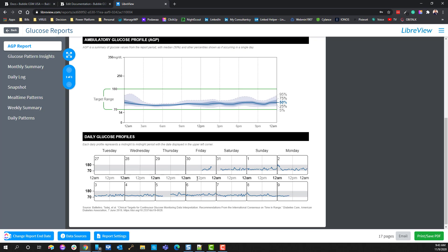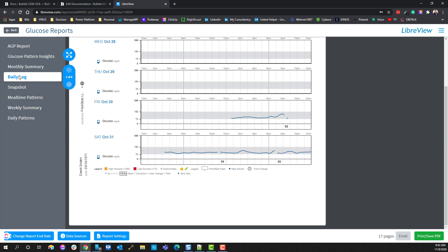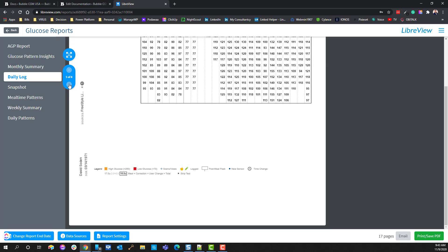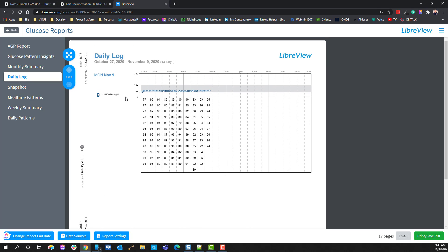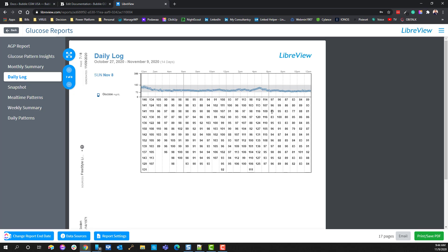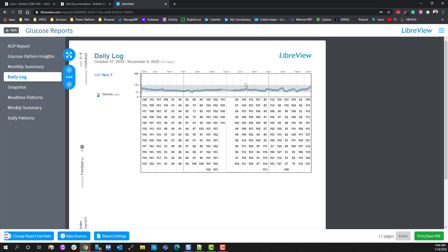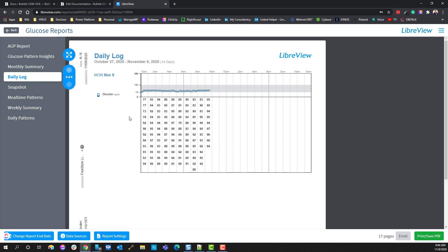And you can very easily check that by going into the daily log, and then specifically going down to the last day, and you will see that you will get all of the different various readings in there. And then, of course, you can always go back and check what's going on from the back side, and check other days to make sure that you're still getting data flow through on the various reports.